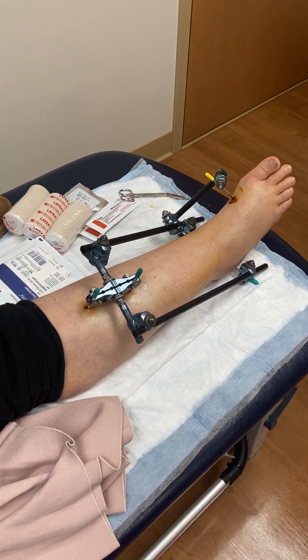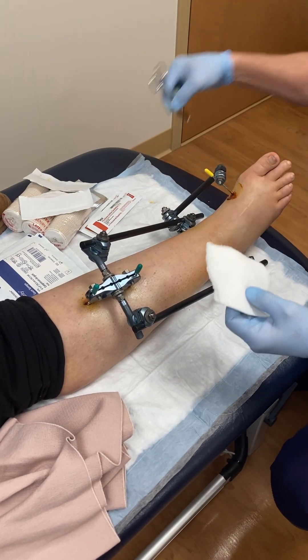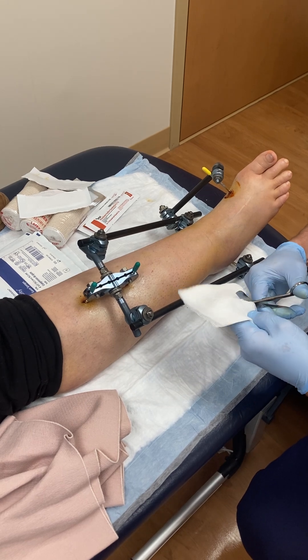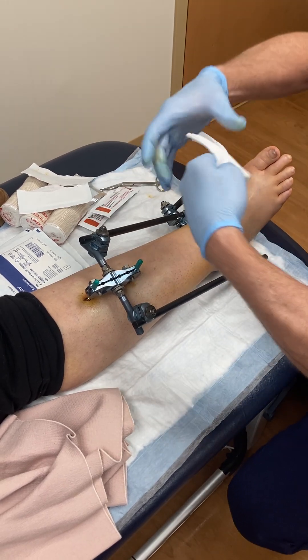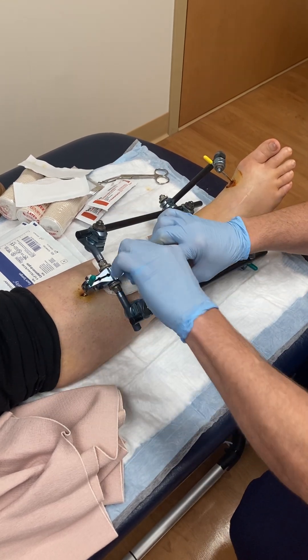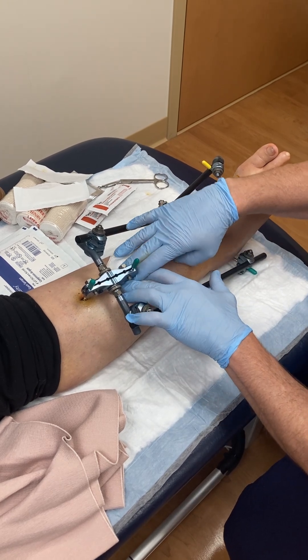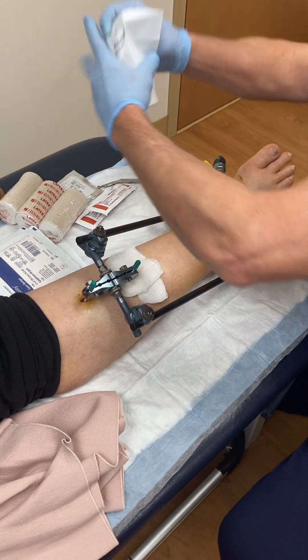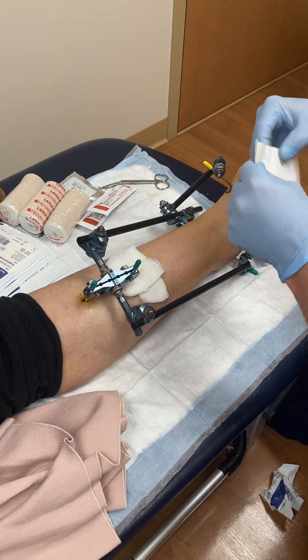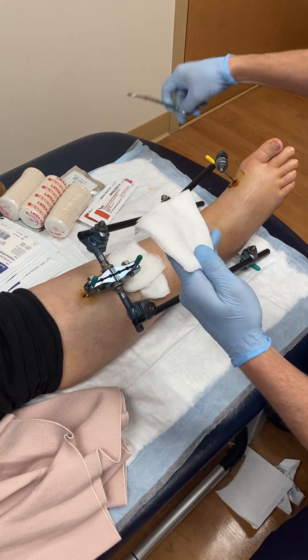We have sterile gauze and just a few pieces of it, and we kind of repack around the pin so there's a nice little sterile gauze dressing in there. Then we redress it with an ace wrap. I put the gauze on there, make a little cut halfway through, and kind of push that down around all these different sections.